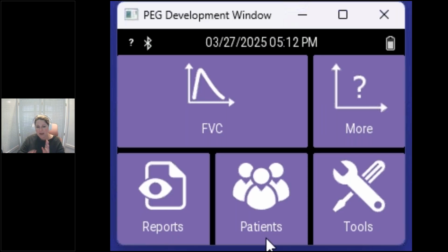Again, I did say I'm going to switch back and forth just a little bit. If there's anybody on the call that had used the previous model, the EasyOne Plus, there's a couple of things. We do get asked this question quite a bit. You can Bluetooth this to your computer, both for live testing with the EasyOne Connect software, and also for data management. You can also be connected with a micro USB through your EasyOne dock here. So one is to a printer or to a computer with a USB, and then the other is the power cord.